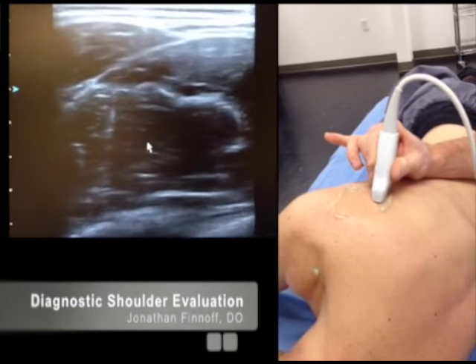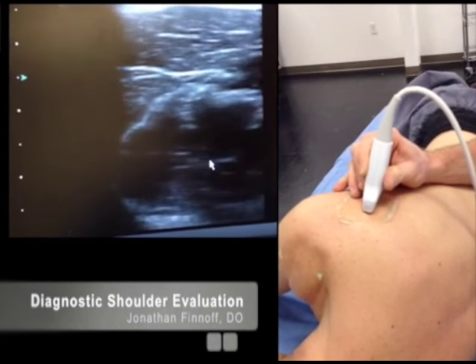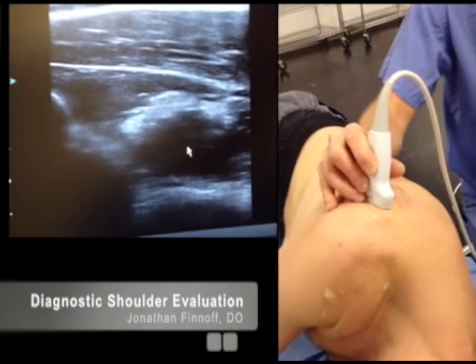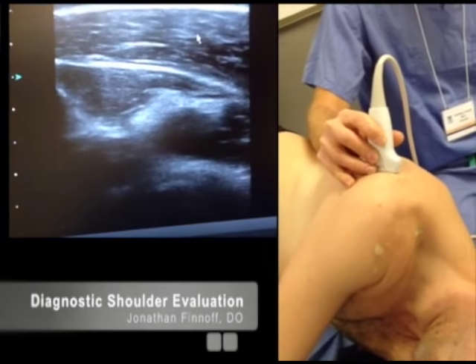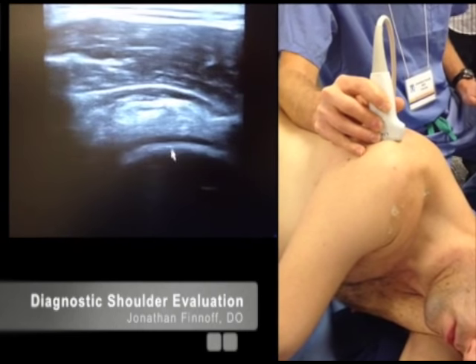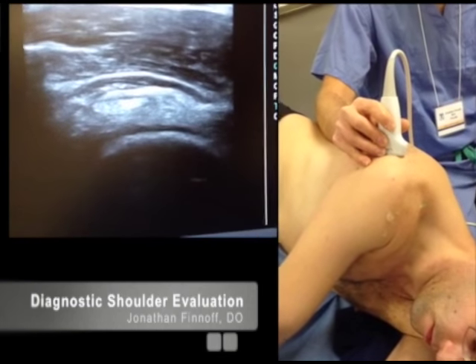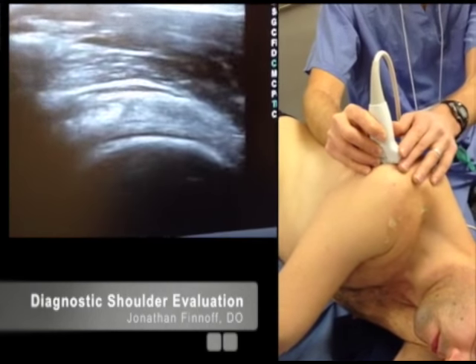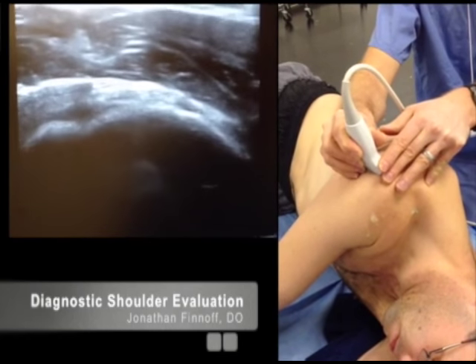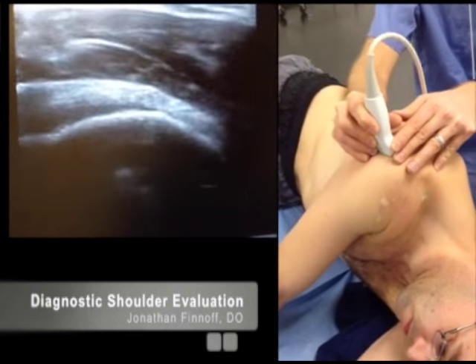Now I'm going to start gliding laterally, keeping my transducer over the top of the infraspinatus. You can see the infraspinatus tendon in the center with muscle on either side. We're getting out to the posterior deltoid, crossing the posterior aspect of the glenohumeral joint, and now over the humeral head — you can see articular cartilage right here. I'm going to keep scanning laterally, wagging the transducer to maintain a hyperechoic image, all the way out to its insertion on the middle facet of the greater tuberosity.